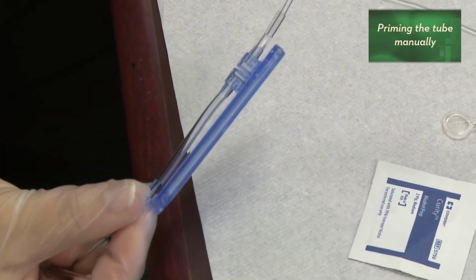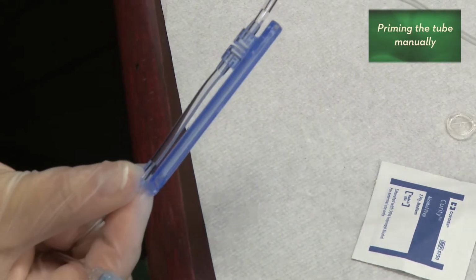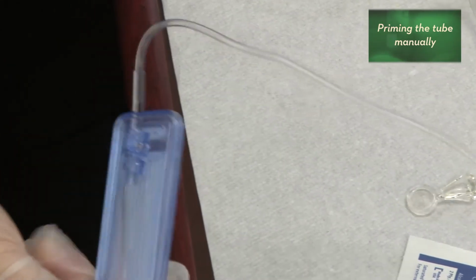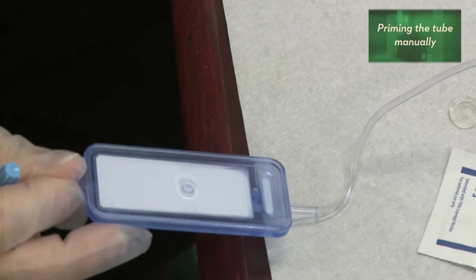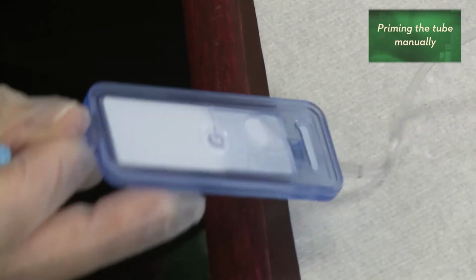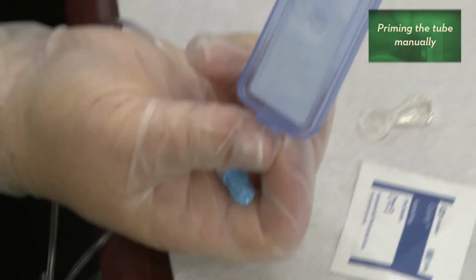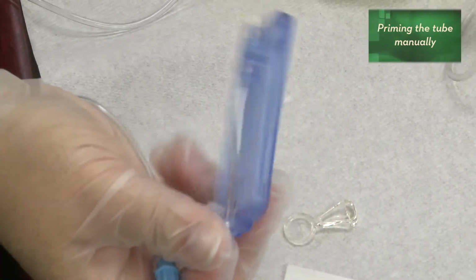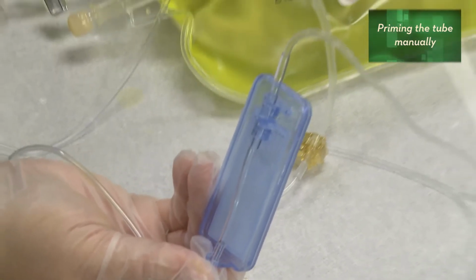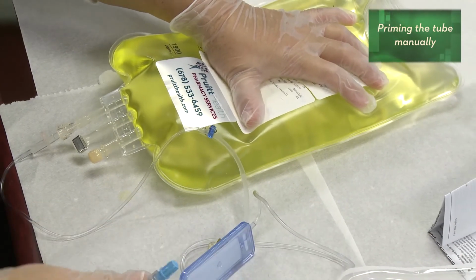I kind of have to mash on the bag to get this to run through easily, and you can kind of see it running into the tubing. It's just getting into the filter, and it's going to fill this filter. You're going to see it start to fill the filter. And then it fills the other side. And I'm pushing on the bag as I go to make it come through faster. If I don't push on the bag, it really won't come through on its own.